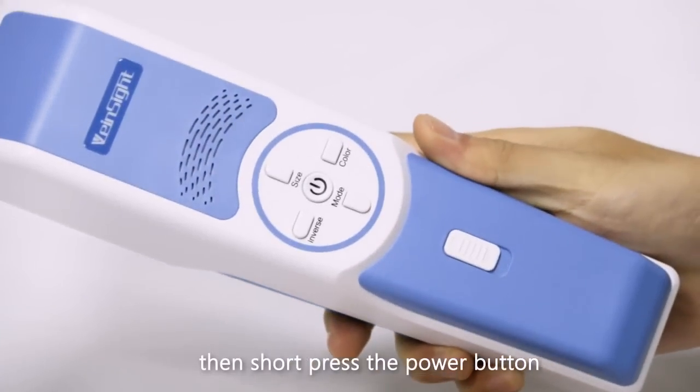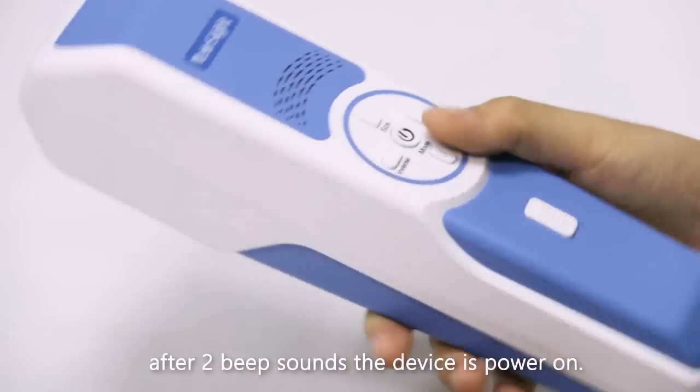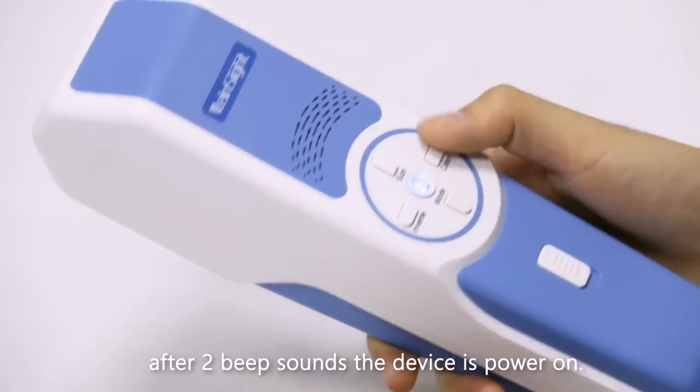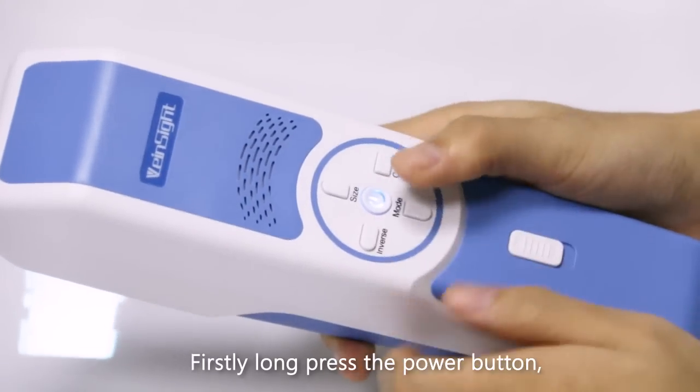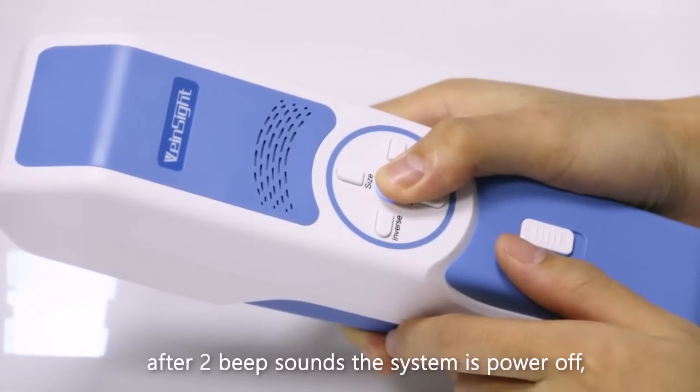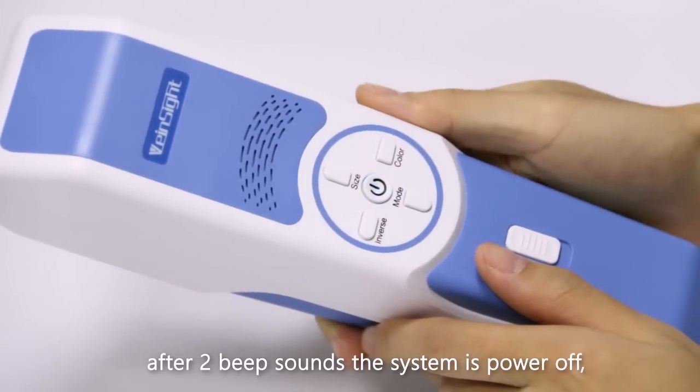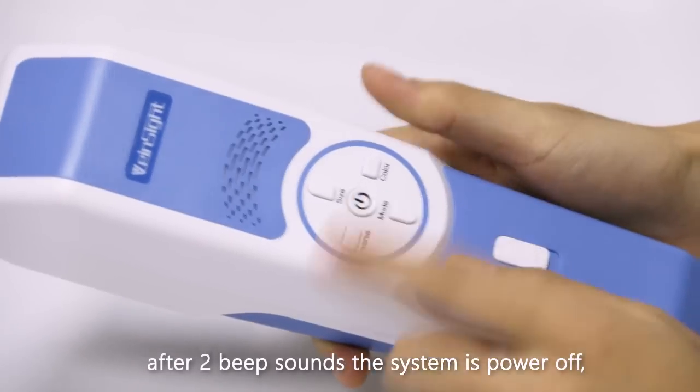How to power on VS 400: First, turn on the main switch, then short press the power button. After two beep sounds, the device is powered on. To power off, long press the power button. After two beep sounds, the system powers off, then turn down the main switch to completely power off the imaging unit.